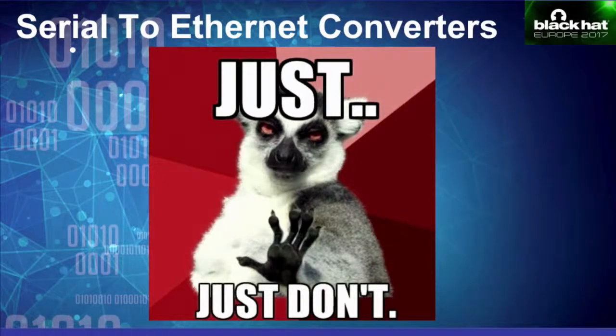they typically operate at a 10 megabit per second link. So if there is another host on the network which operates at, say, 1 gigabit per second, and that particular host somehow went rogue, that alone can exhaust your Ethernet adapter by sending a large number of packets, making it unresponsive and simply creating a denial of service against these devices.